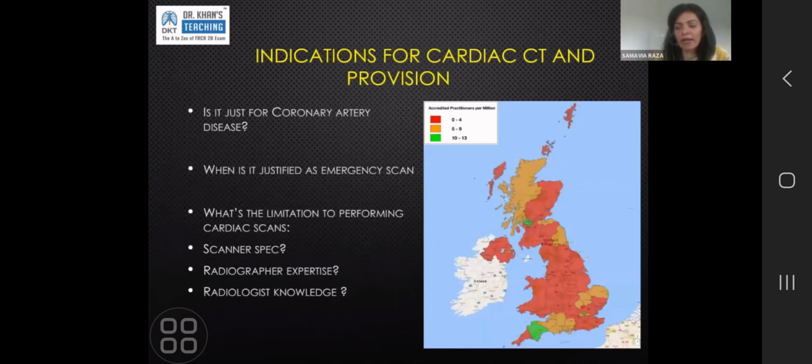In terms of the heart, previously cardiac CT used to be a tool that could be employed for function. If you were to look at function, systolic function or perfusion, it needed a retrospective scan, so that's a higher dose scan. With time, the realization that such a high dose imaging modality to get information that you can get reasonably well with the echo made us move away from that. But now there is again a drive to get perfusion CTs and more complex functional imaging from cardiac CT, but that is because of the better machines and it's not a higher dose scan.